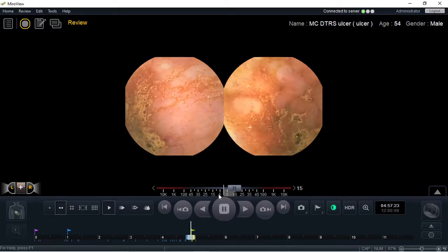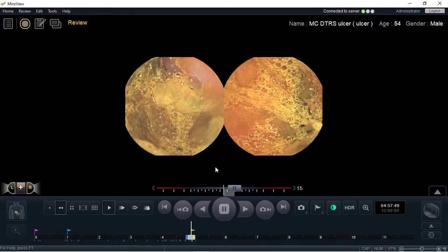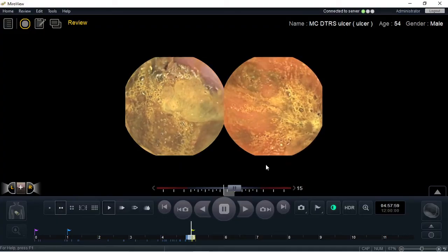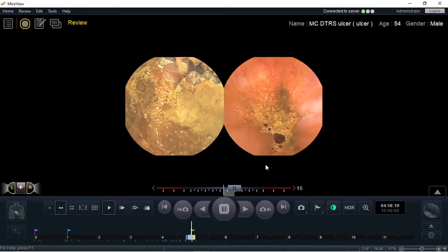If you look on the left-hand side, the capsule is about to migrate into the cecum, as you can see here. On the right-hand side, the back camera is still in the small bowel, still taking time to get into the cecum.